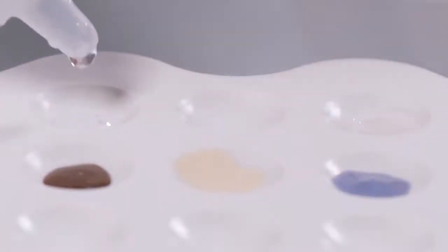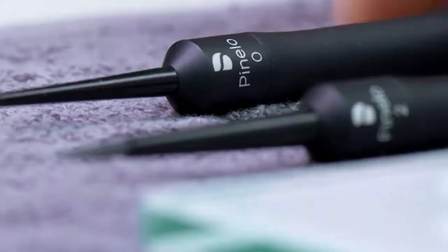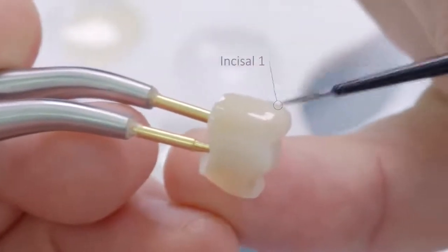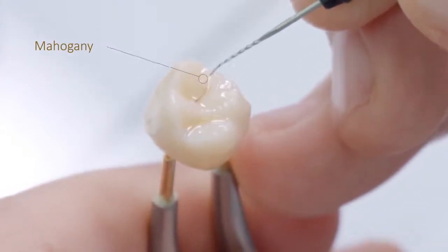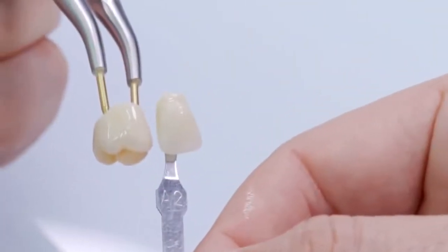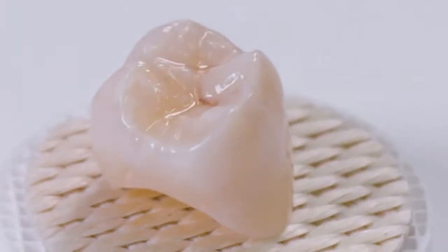Each stain is first slightly diluted by adding stain liquid to bring it to a homogenous consistency. After applying the glazing material in paste form, Body Stain 1 and a small brush are used in the cervical area to intensify the chroma of the crown. With Stain Incisal 1, the illusion of increased translucency of the mesial and distal ridges of the cusps can be suggested. Stain Mahogany can be used to characterize the central fissure. This crown is now prepared for placement and firing in the Cerec Speedfire.